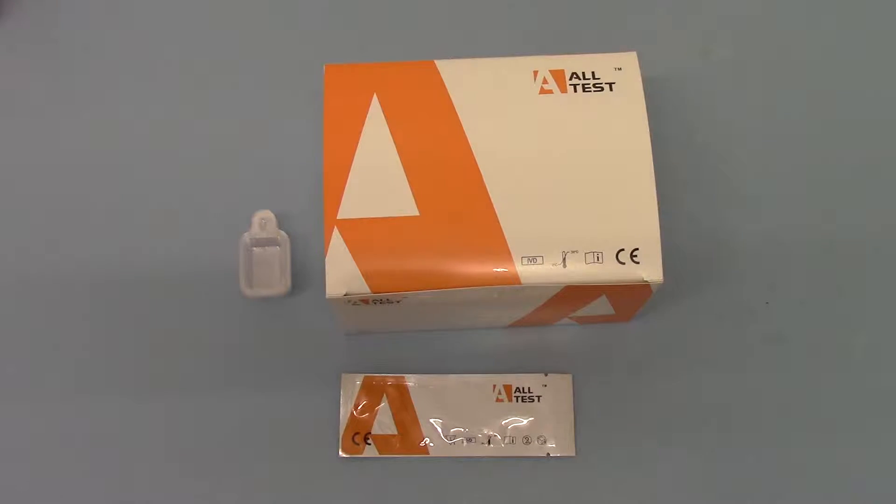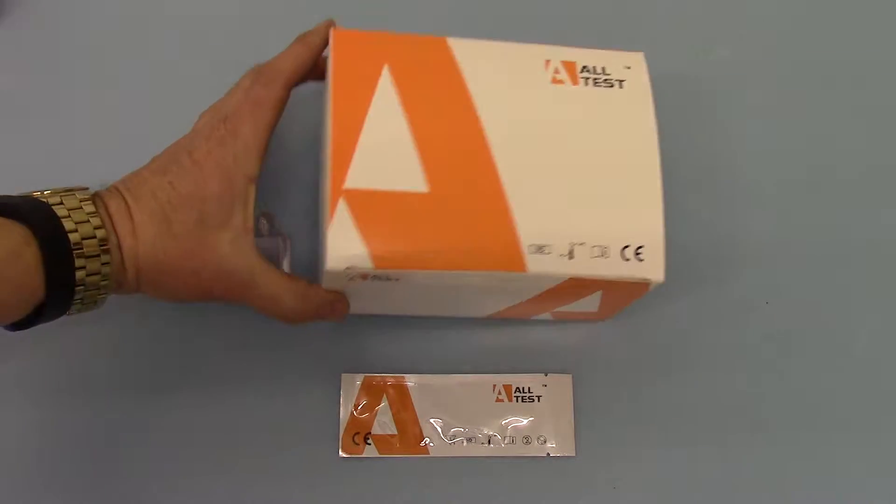Welcome to this video where we're going to demonstrate the new Alltest DAL701. This is a saliva alcohol test strip. We're showing you the cartons here — this is the standard Alltest carton.